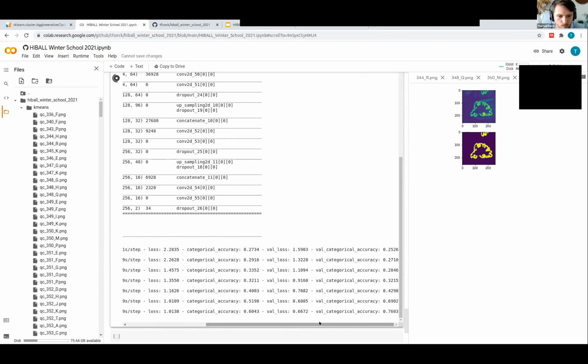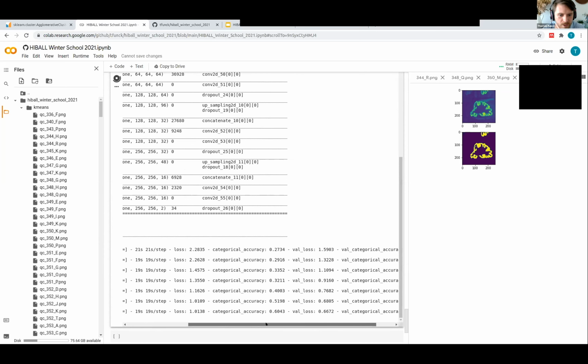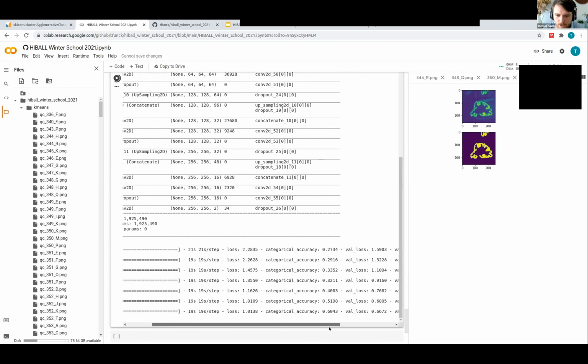If you start working with these things, you'll end up spending a long time staring at the screen as these numbers hopefully go up, like you're watching some kind of sports match or something like that. Which is maybe not the best use of time.